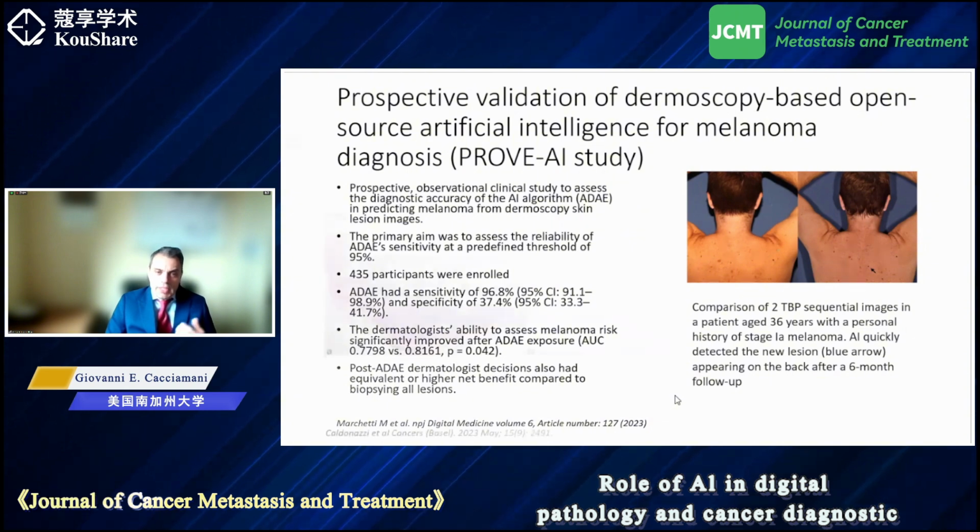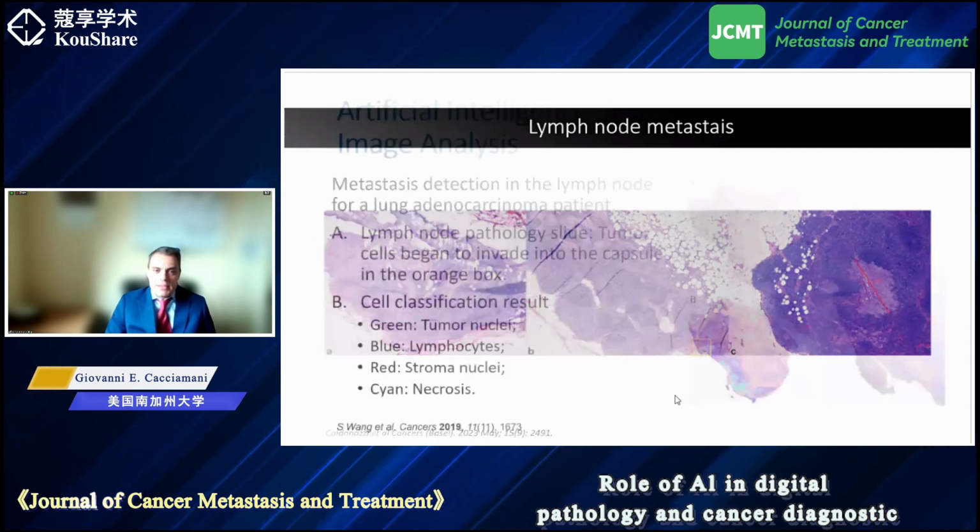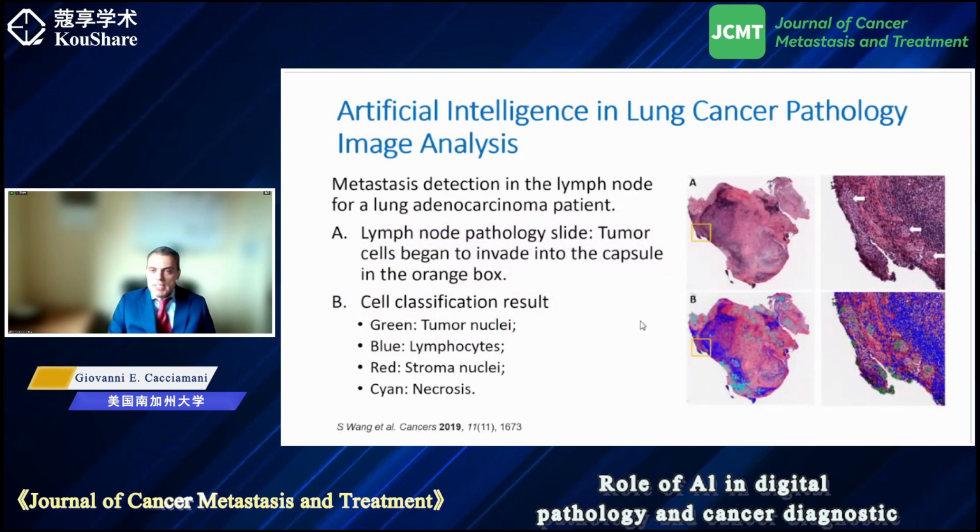So very important in the dermatological examination. But one of the settings in which digital analysis has emerged most prominently is the evaluation of lymph nodal metastases. And here is an example in lung cancer.